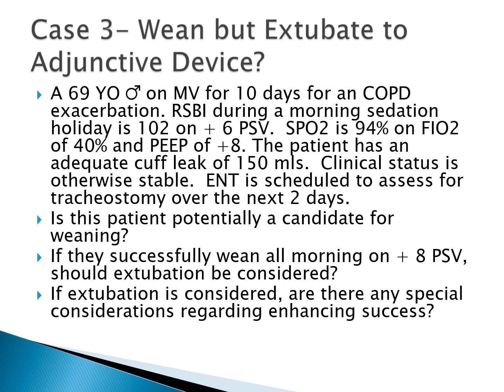This is a patient who's not ideal, but they may be close to the best version of themselves. They may saturate at home at 92 or 93 or 94. So now they're at 94 with a little bit of a boost, FiO2 wise and PEEP wise. So they may well be a candidate for weaning. Let's give them a shot.